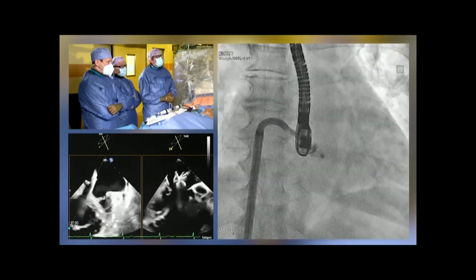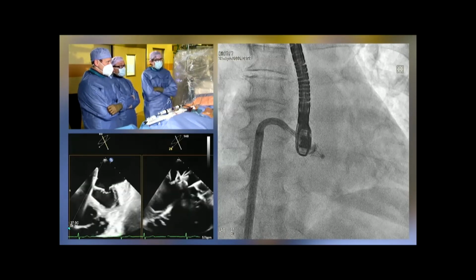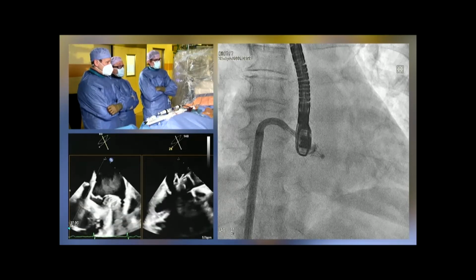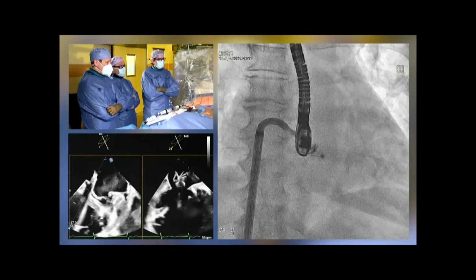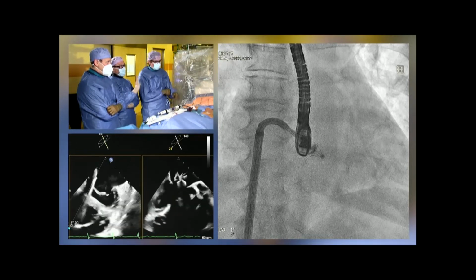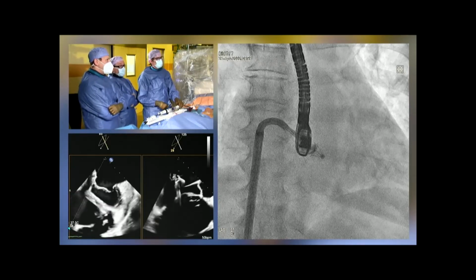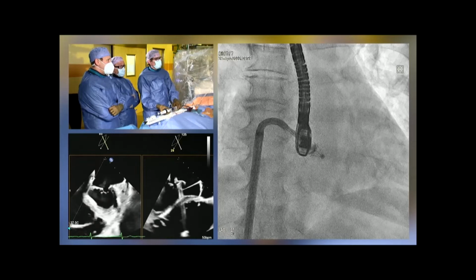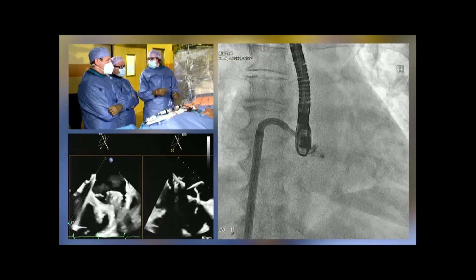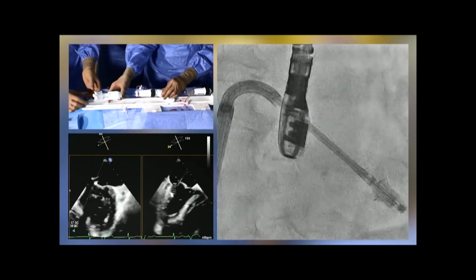I must say, I changed my way of working a little bit. I'm very open to individual grasping, also for the first grasp, and swing over. This technique really allows you to have an optimal visualization of the one arm and the one clasp with the leaflet, and then you can swing over to the other one and focus on that one. Yeah, I totally agree.